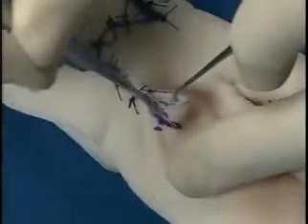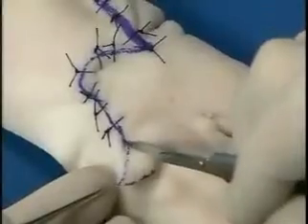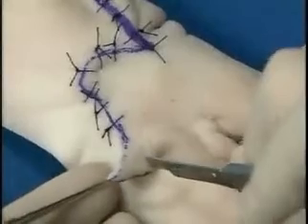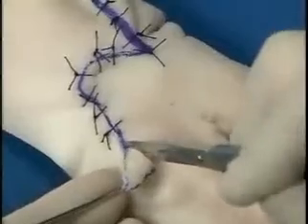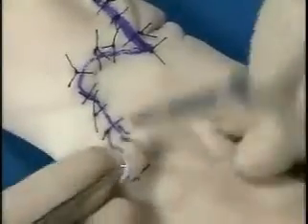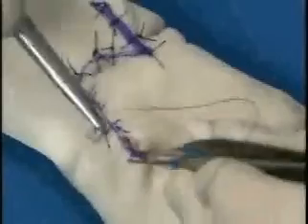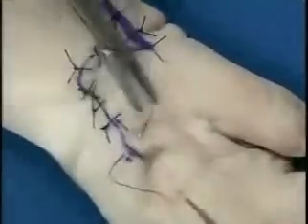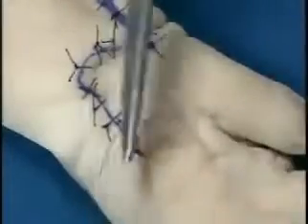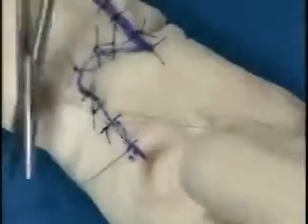We can see using the hook that we have excess, and this excess is now trimmed off, removing the dog ear and allowing the flap to inset nicely into the area of the defect. This is a relatively fast and easy technique to remove the dog ear. And now the sutures, one or two may be placed depending upon the amount of tissue that needs to be closed. The sutures are now placed to complete the closure of the wound.